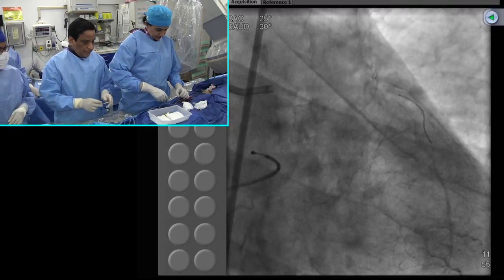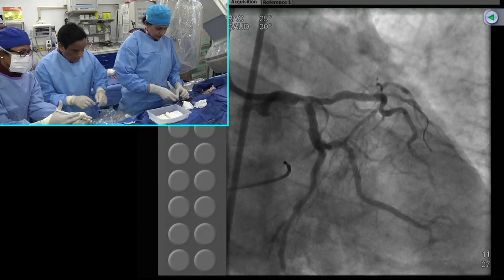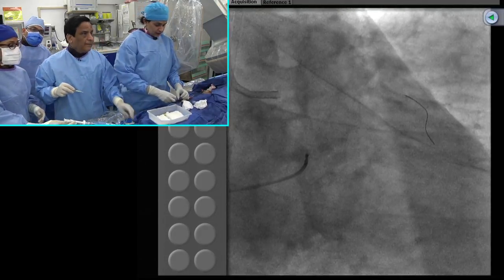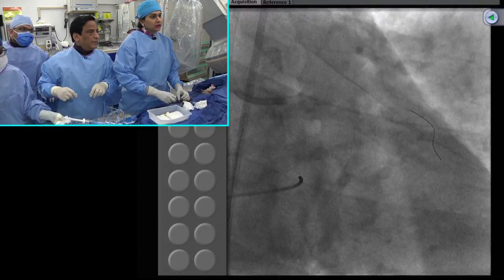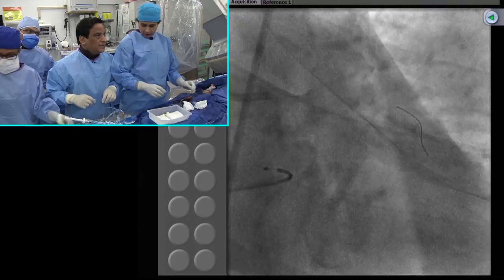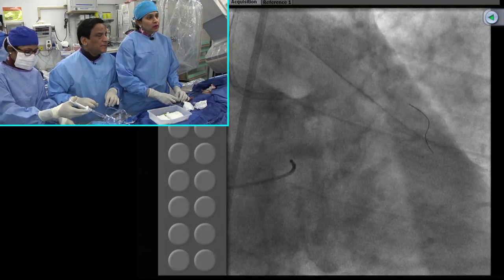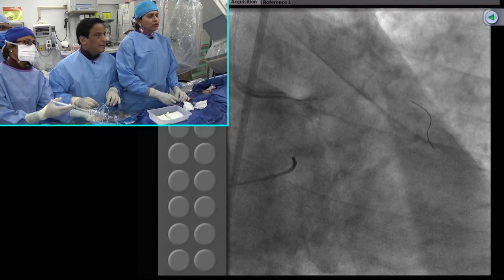Yes, rota. I think it's very calcified, and we should definitely do the rotablation of the circumflex also. You're going to try getting the rotawire there? Yeah, exchange it first. This is the case of exchange because the rotawire will not have that. Anu, you had no concern that the rotablator wire was in a diagonal instead of the main LAD? No, because we knew we are going to go to that short segment, only proximal LAD, even if it's in the diagonal.